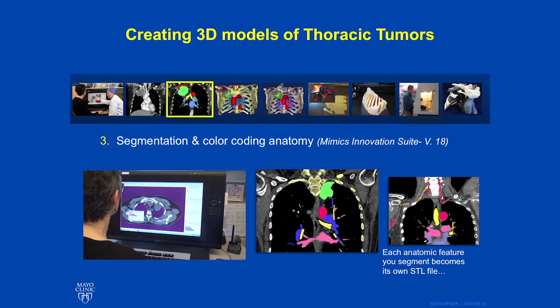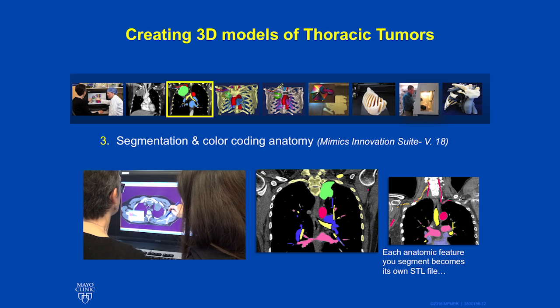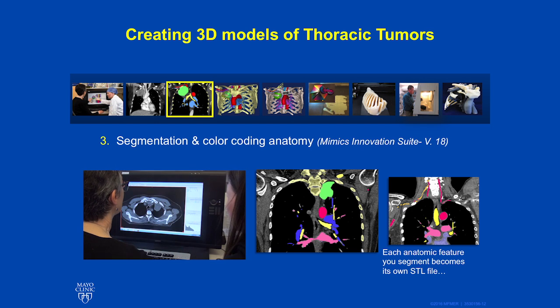The team works together to select different regions of interest and exclude areas that are not of interest, carefully selecting and creating the model, integrating the different images, and carefully using the thresholding to select those Hounsfield units of the properties, for example, the tumor, that you would like to present. Once that is complete, cleaning up of these images is still required.